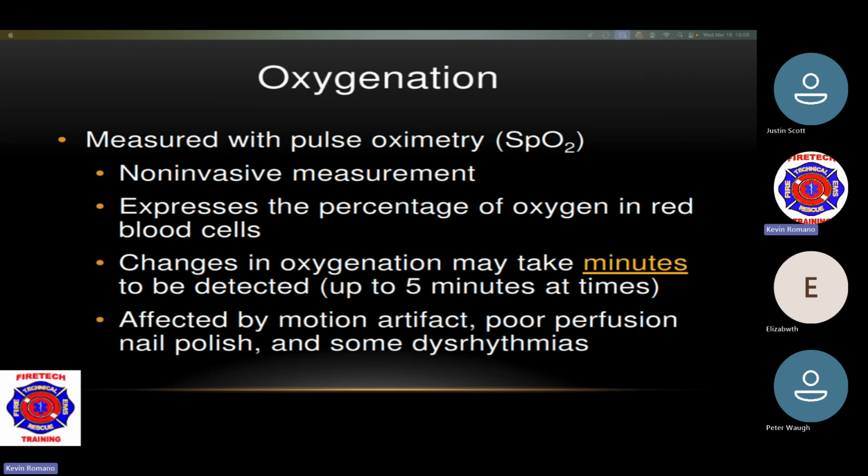So oxygenation is measured with pulse oximetry, or the SpO2. Keep in mind that these are all tools, but they do not take away what you can actually physically see going on with your patient. Okay, these are all tools of the trade that help us with differential diagnosis for treatment.